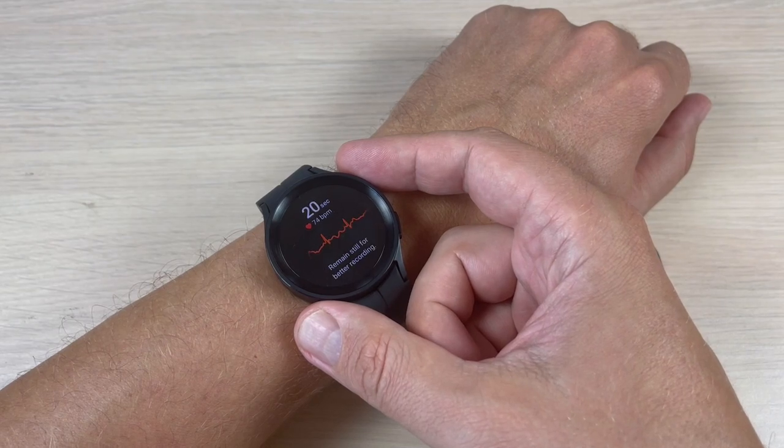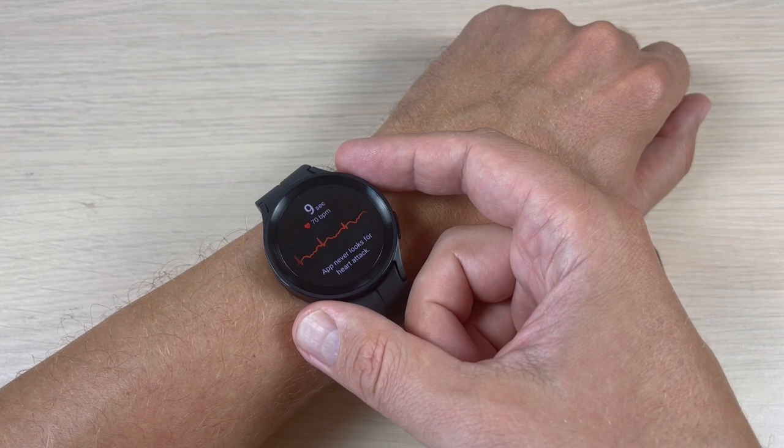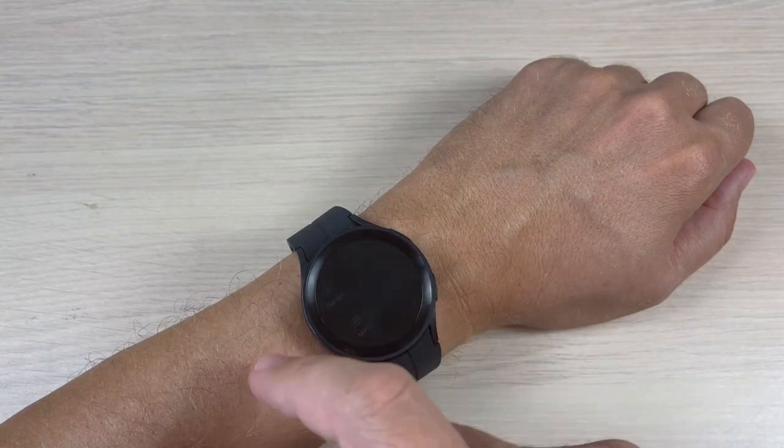Hi guys and welcome back on GSM ABC YouTube channel. In this tutorial I will show you how to measure ECG on Samsung Galaxy Watch 5 Pro. So to do that on your watch, just swipe to the right and we have here ECG.